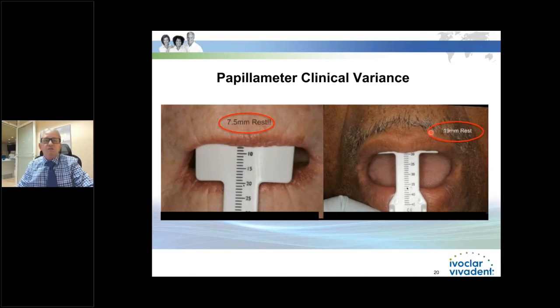We've all been taught to make an upper occlusal rim 22 millimeters long in the front, and most likely around 18 millimeters in the back, or 12 millimeters, according to what school you went to. And if you were to place that into this patient's mouth, you would have to reduce the occlusal rim probably the next 15 to 20 minutes to get it proper. With this particular patient, you would have to add to it.